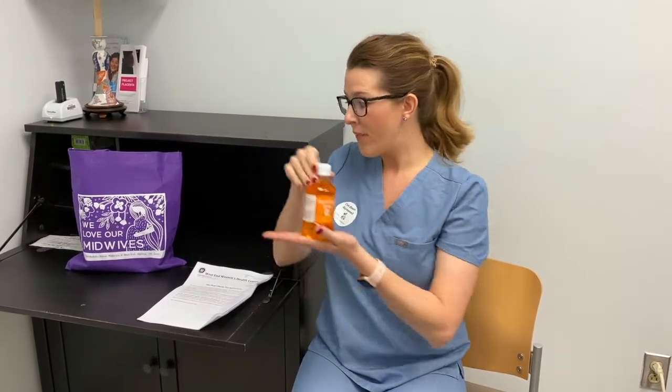With this test, it is okay to eat breakfast or eat before you do it. You just want to avoid excessively sugary foods. So if you typically eat donuts for breakfast and that's what you have every day, then go ahead and do it and drink this drink. If you typically eat granola or yogurt, don't choose today to eat donuts before you drink sugar and then we test your sugar. So that is that.